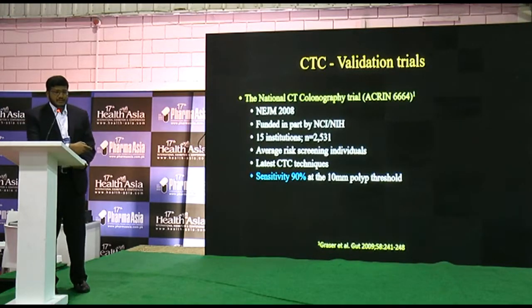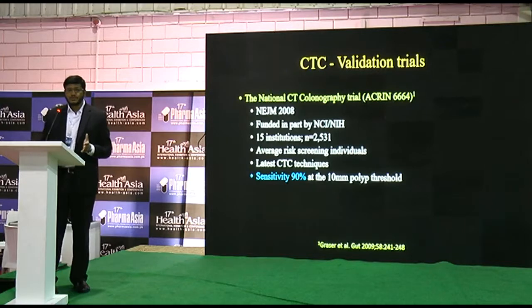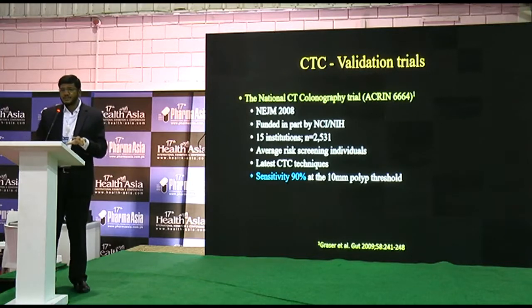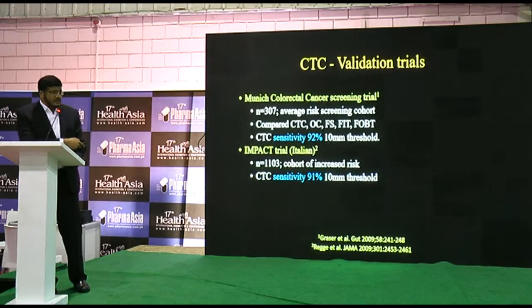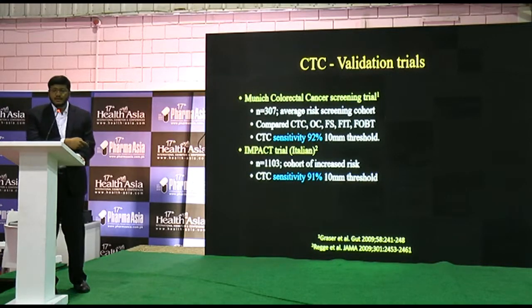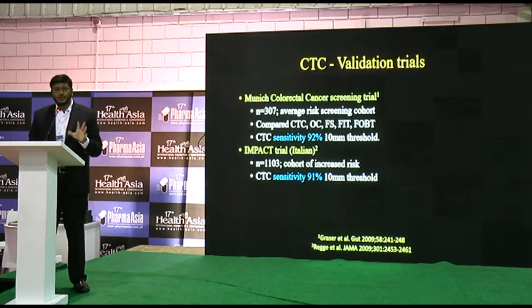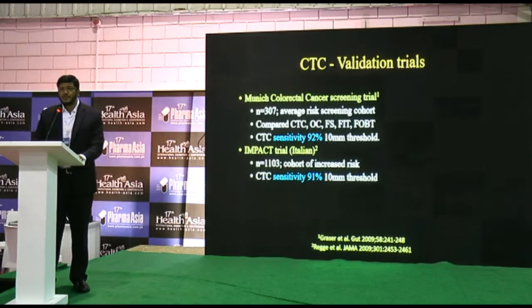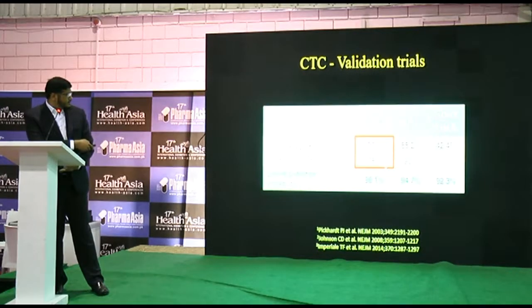As far as the CTC validation trials, this is the largest national CT colonography trial of America, conducted in 15 institutions of the United States. There are other trials done in Munich, Germany, and the IMPACT trial of Italy. These all suggest more than 90% sensitivity for CTC for polyps of size 10 millimeters.